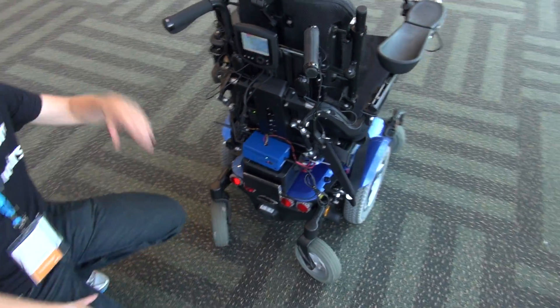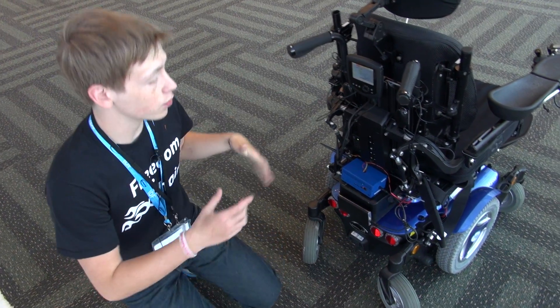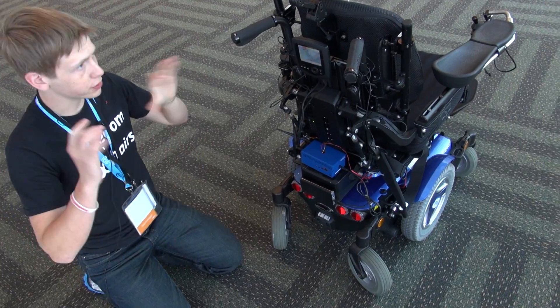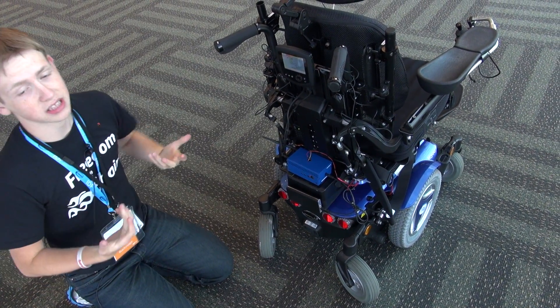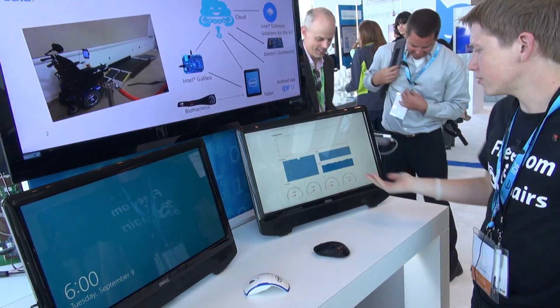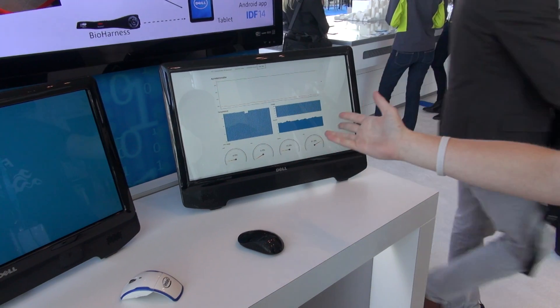All we're using is an Intel Galileo. We did six weeks of user testing with three wheelchair users and put the whole system on their chair — bioharness, tablet, everything — and we collected the data. We're able to show the data right here. This is a live stream of data from the wheelchair, so obviously it's not doing very much right now.